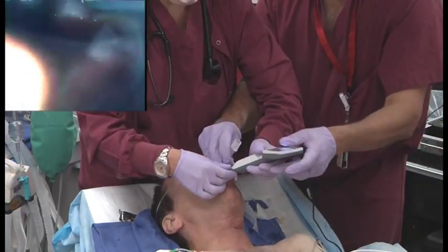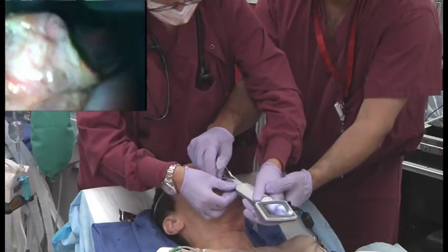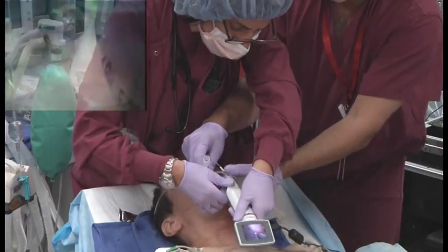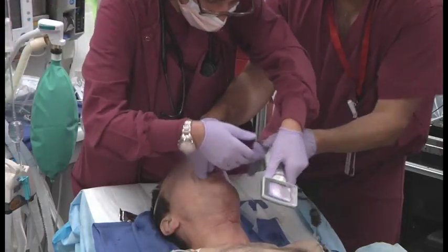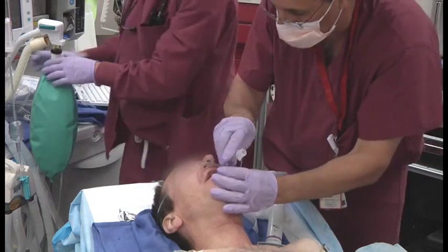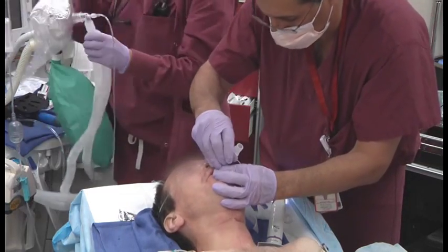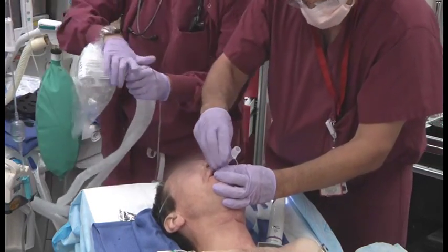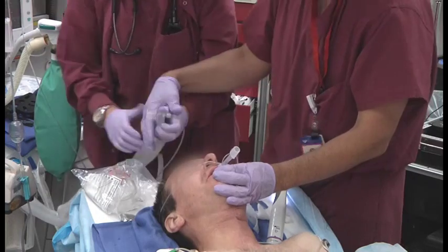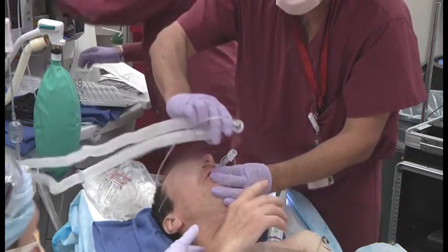The bougie has been removed, followed by the removal of the video laryngoscope. Endotracheal intubation will be confirmed with the detection of end-tidal CO2, and general anesthesia will be induced.